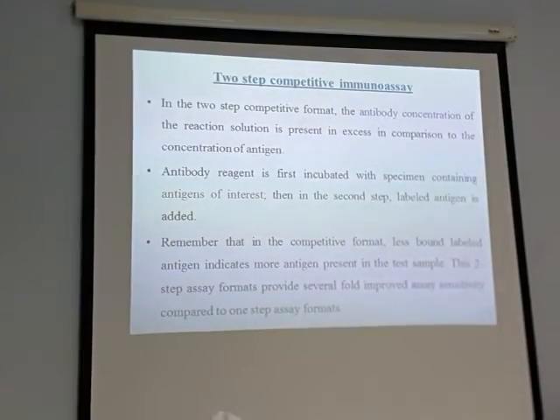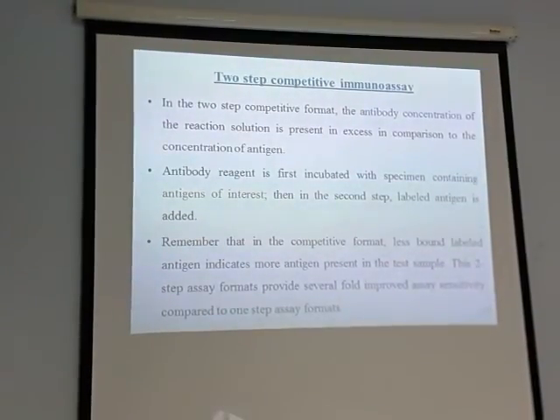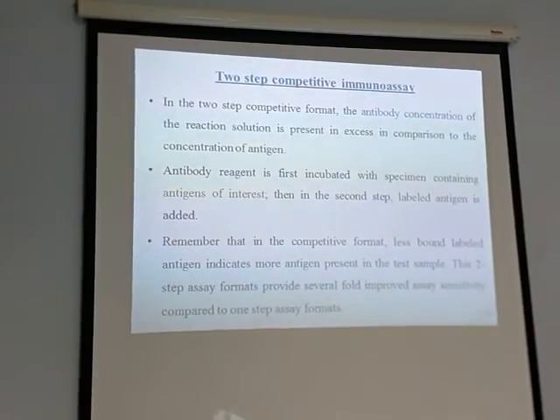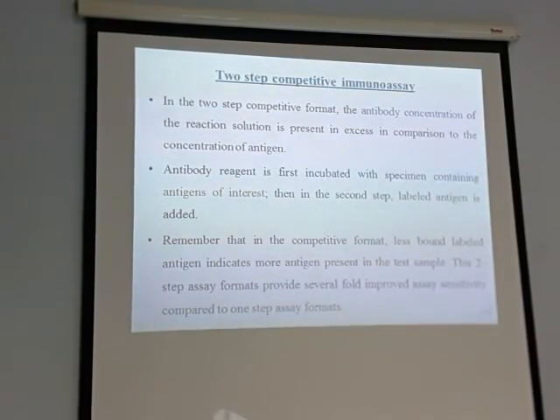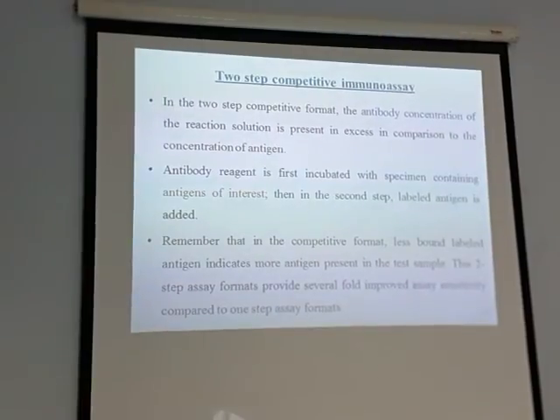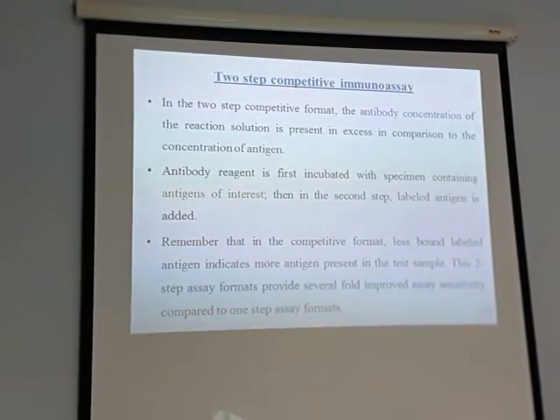So then what happened? First when you incubate with the unlabeled antigen, most of the antigens will bind to the antibodies. So there is a chance for more sensitivity and reliability. In the two-step competitive immunoassay, the sensitivity is very high because we have a large number of antibodies.